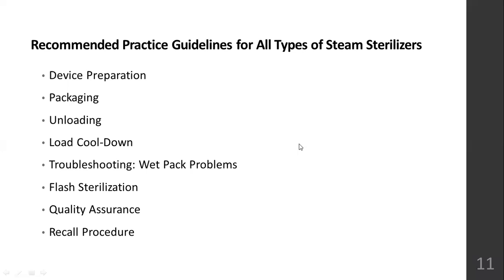He or she will inform the department heads, the department nurses, staff nurses, and in-charges, and they will check the load number, because you have to give the information on which load number, on which day, the article that has arrived on which day, which load numbers are considered unsterile. That information has to be passed on to the ward in-charges, and they will check their inventory. All the items that have a similar load number will be sent back to the CSSD. So that is the recall procedure.